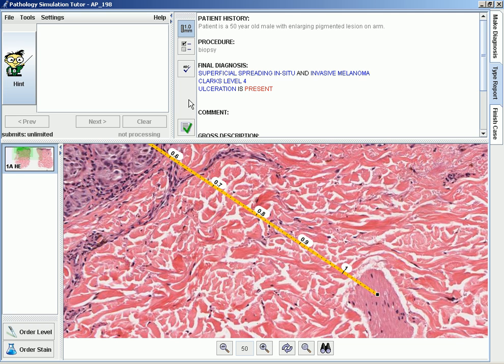There's also a tumor staging worksheet. The tumor staging worksheet is used in giving a final prognosis. In the worksheet, you can assess the primary tumor, regional lymph nodes, and distant metastasis stages. So that's this next button down here.